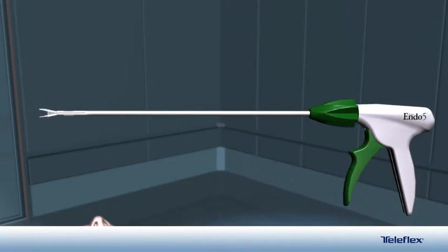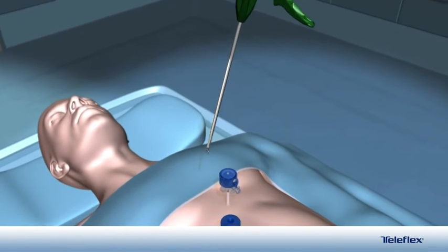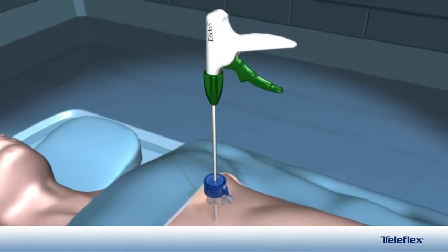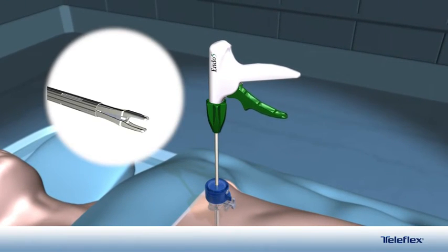A WEK Hemolock Auto Endo 5 mm clip applier is inserted through a 5 mm port. The handle of the applier is squeezed to load a clip into the jaws. A distinctive audible click is heard, indicating the clip is fully loaded.